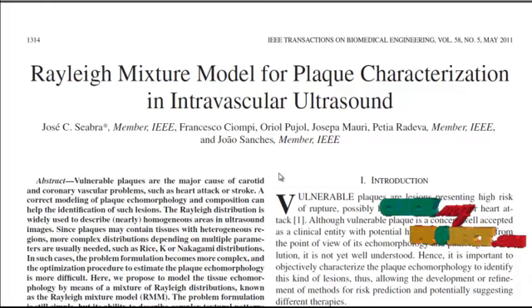We present the method for the automatic estimation of the RMM mixture parameters by means of the expectation maximization algorithm, which aims at characterizing tissue echo morphology in ultrasound. Rayleigh distribution is a fully automatic method for contour segmentation. The result of image segmentation is a set of segments that collectively cover the entire image, or a set of contours extracted from the image. Each of the pixels in a region is similar with respect to some characteristic or computed property, such as color, intensity, or texture. Adjacent regions are significantly different with respect to the same characteristic.